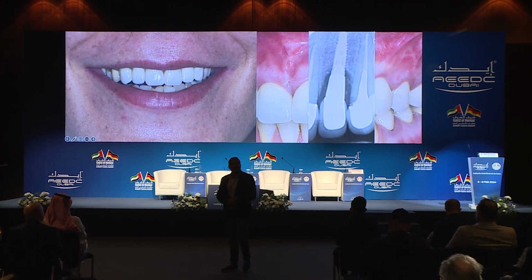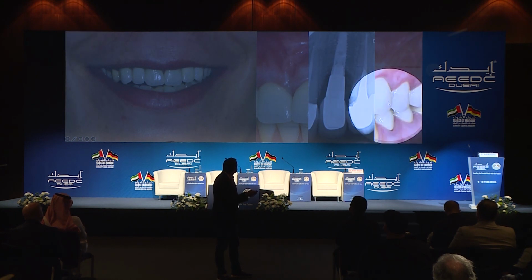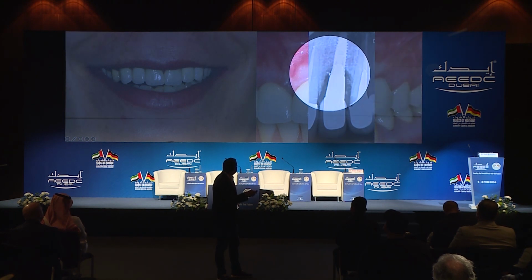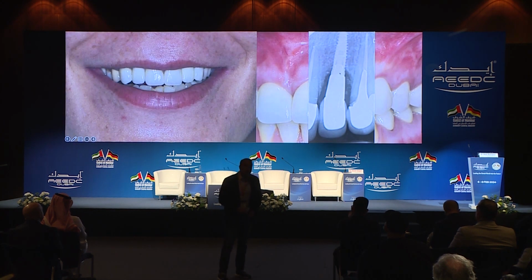And when I took an X-ray, I was like, look at this. Look how deep is the implant. I mean, this is like an 8 or 9 millimeter deep implant. The implant should be here. So we have a deep implant placement.